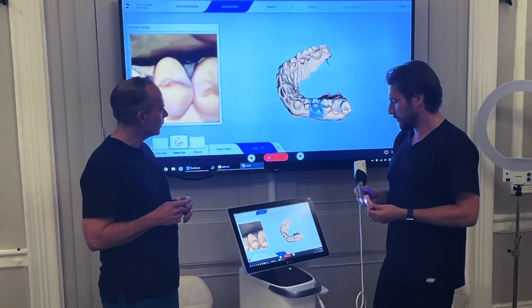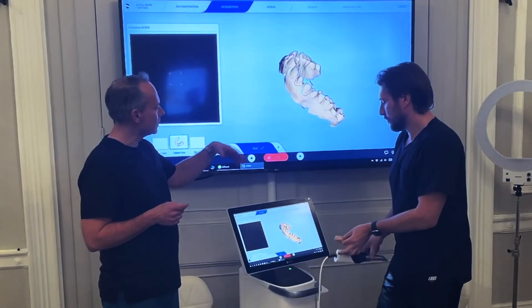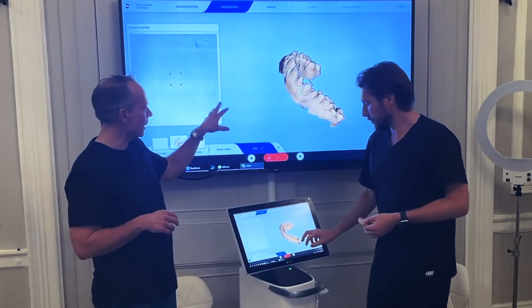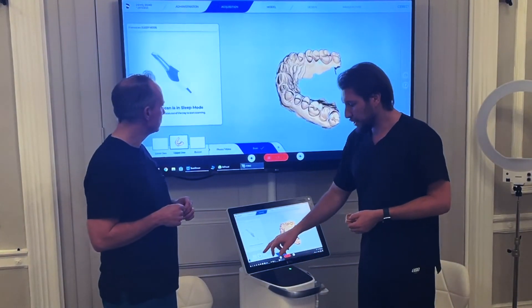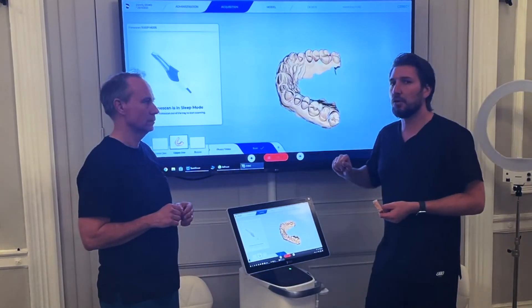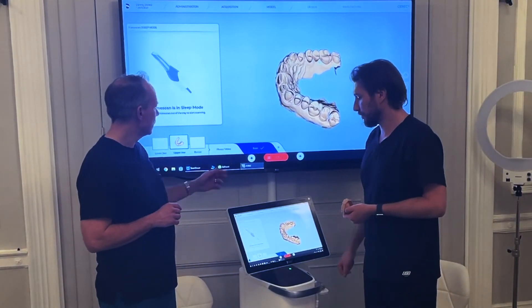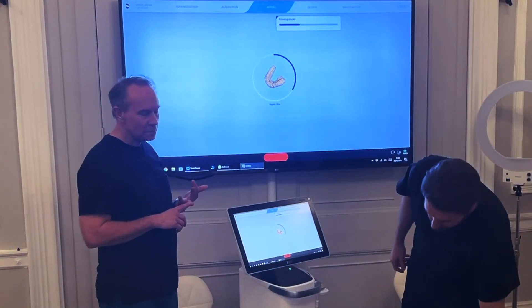Here we have a little hole, but on the other hand we have a really nice scan in the area where we're going to do the crown, so that's good. We don't need the others since we don't have them. Because we didn't take a lower, it's going to let us move forward. So we'll click 'model.'